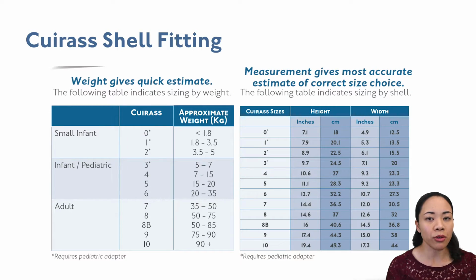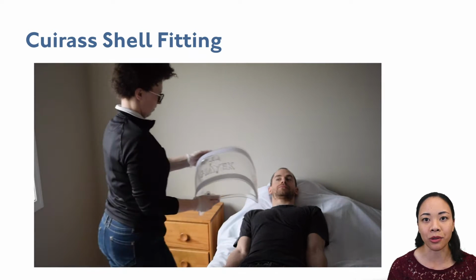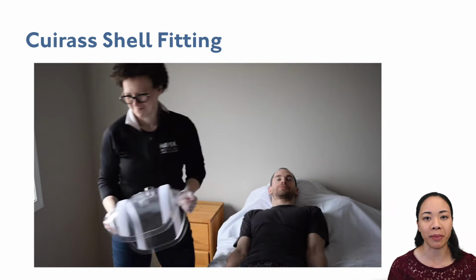However, please also note that these are initial guides to choosing the correct shell size. The more that you, as a clinician, utilize BCV, the more skillful you will become in selecting the correct shell size by sight alone. You would be able to hold the Cuirass shell to the patient's chest and determine which shell size would work best for them.